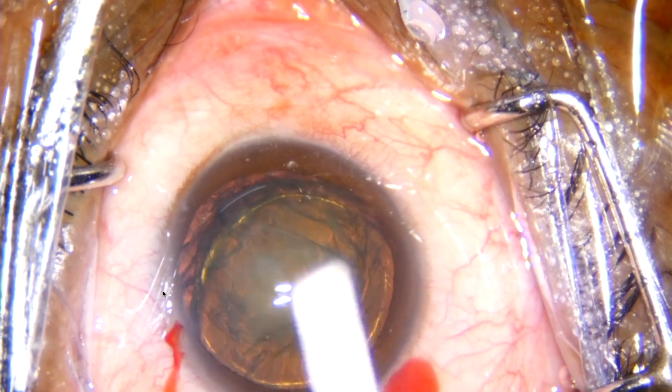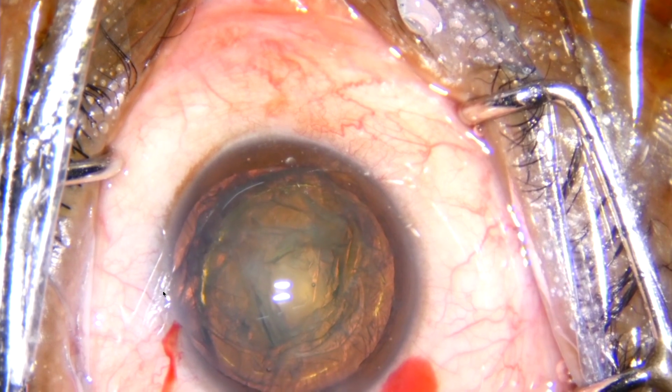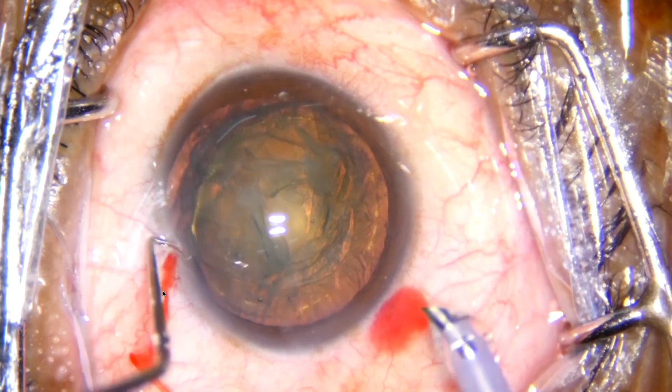If you do it further, you can easily bring out one pole. It is very easy. When you do a 5.5 millimeter rhexis, and it is a grade 1 to 2 nucleus, you can bring out one pole. This is called the Phaco salute.